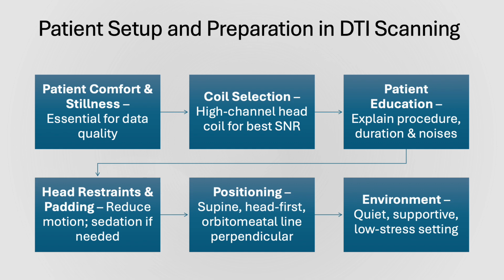So also take time to educate the patient before scanning. Explain what DTI is in simple terms, stress the importance of keeping still and let them know that the scan may take longer than usual, and also warn them about the loud noises from the gradients.